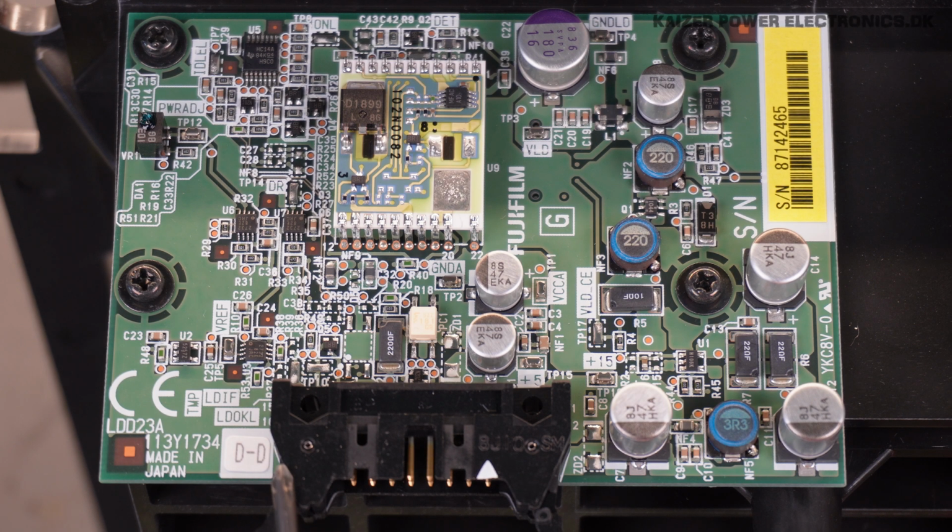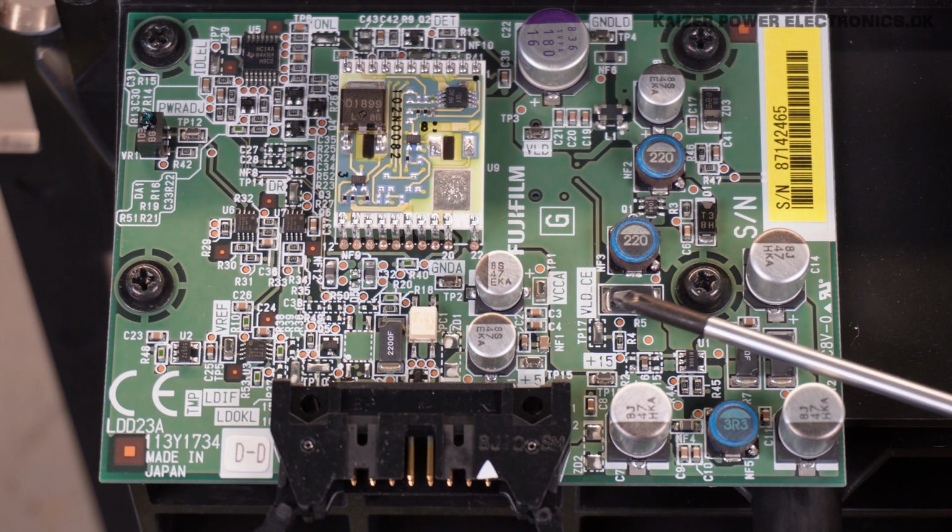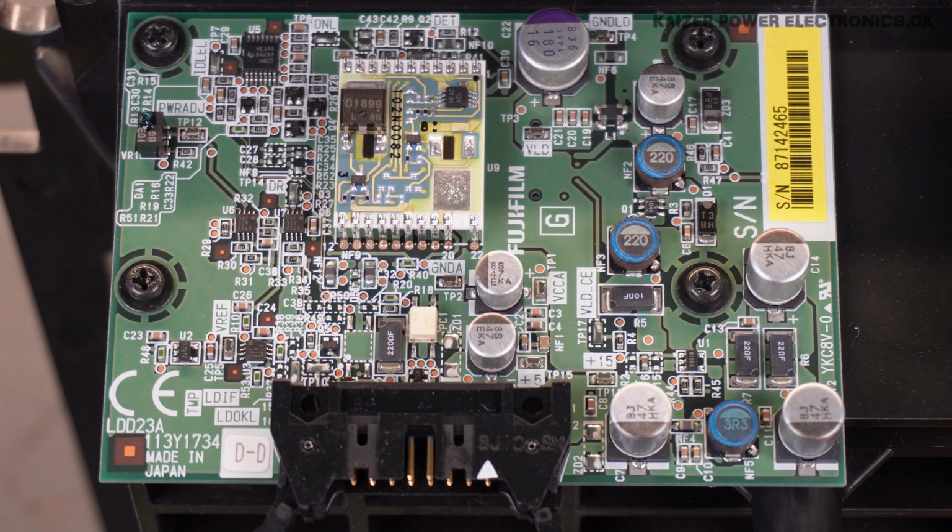The laser module has a 16-pin input header. It also seems to have its own power supply, which is this one over here, a constant current power supply. Then it also has some feedback sensors, and it seems to be taking plus 5 and plus 15 volt DC. As we can see from the markers in the white silkscreen, it actually has a lot of diagnostics. Because, again, this is X-ray image scanning, so we have to be quite sure that the laser is operating just as expected. I have very little hope of reverse engineering this very complex board and making it run, so I think I will just drive the laser diode by itself.